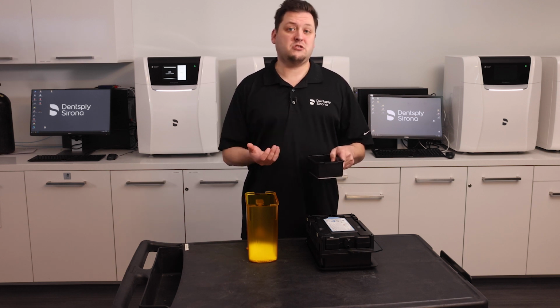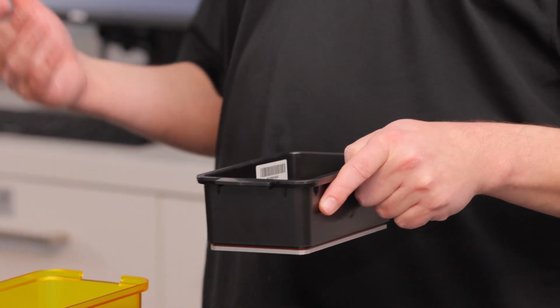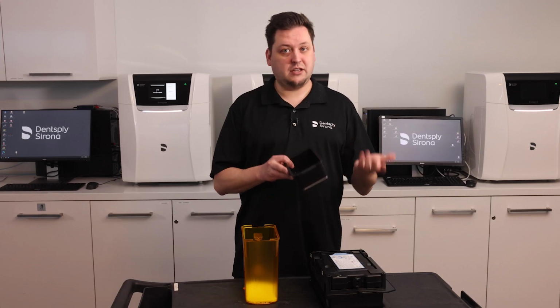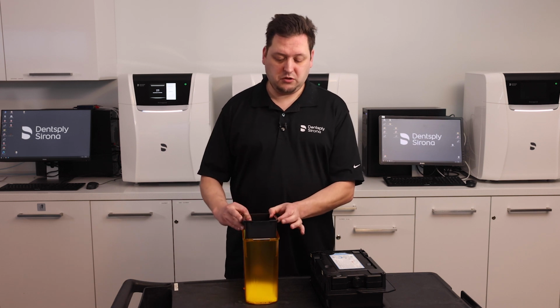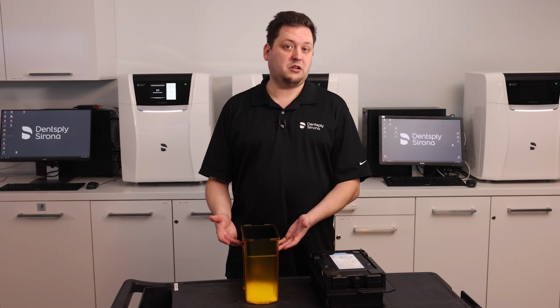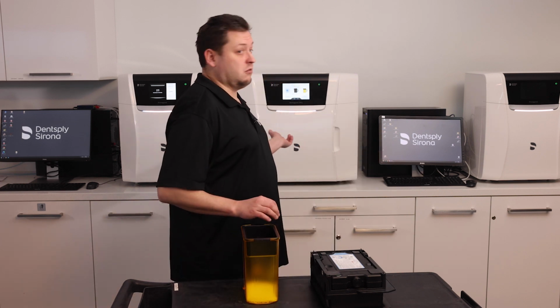That means if I choose to cancel the preheat process or discover I need to print with a different resin type, I will need to cancel preheat, which will put the build plate back into my Primeprint box. I'll then need to either manually clean off that resin that's underneath, or I could run it through the PPU.